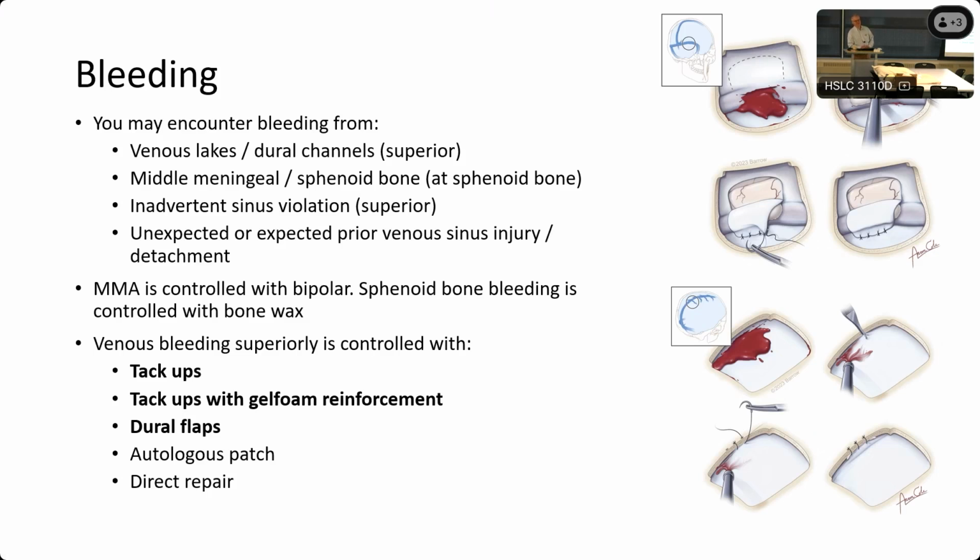Yeah, we already started with blood everywhere. Yes, it was a big problem because he tore the sinus in many spots. So this is where having a system, or potentially a co-surgeon here, helps.